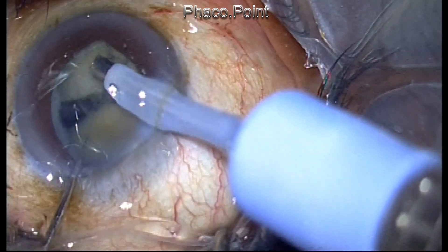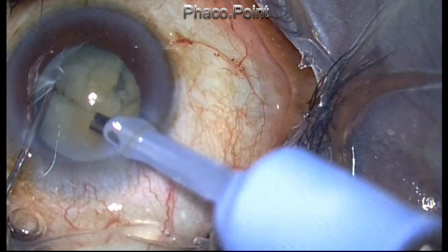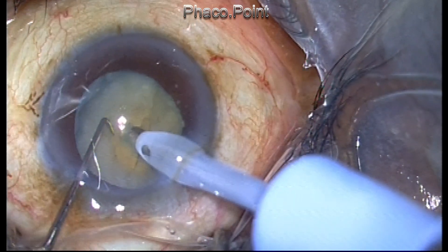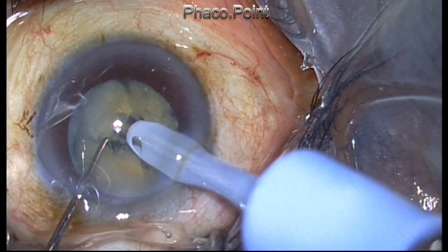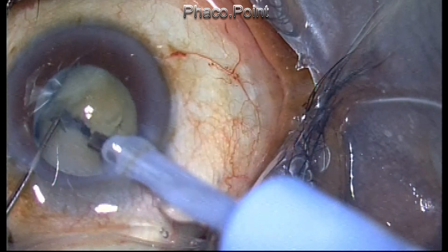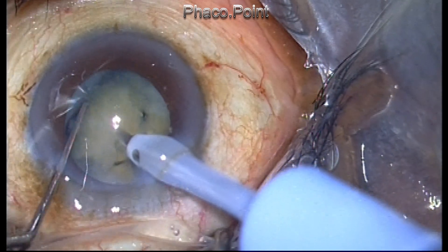As the nucleus gets chopped, the central portion is found to be hard. At the periphery of the nucleus there is something like a wreath of thickened cortex. This wreath of thickened cortex at the periphery will be quite difficult to remove because it is not liquefied — it will not get attracted and come to the center. Let's see how I manage this.